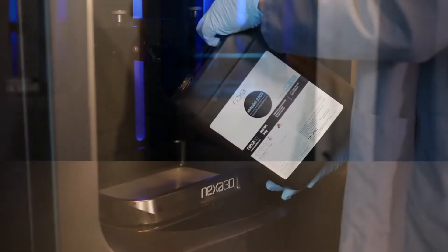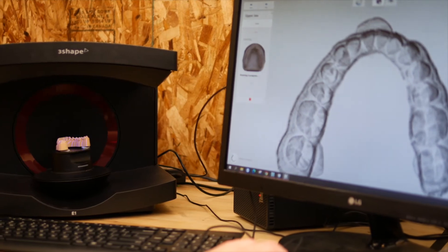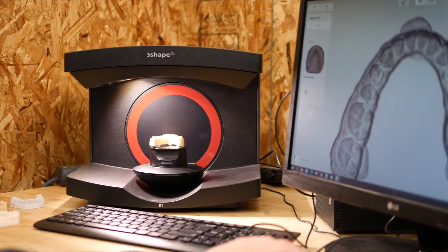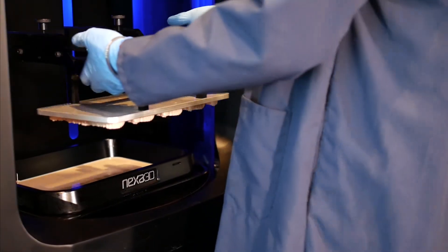Developed with the needs of environmentally conscious dental labs and dental clinicians in mind, X-Model 2505 produces crisp, accurate models at a productivity level not matched by any other platform. Produce a full platform of liner models in under 20 minutes at 100 micron accuracy.